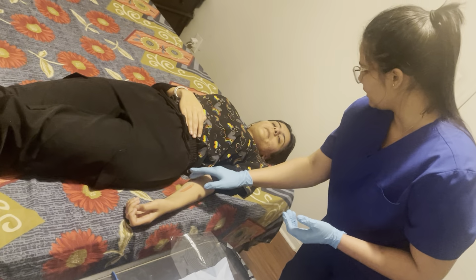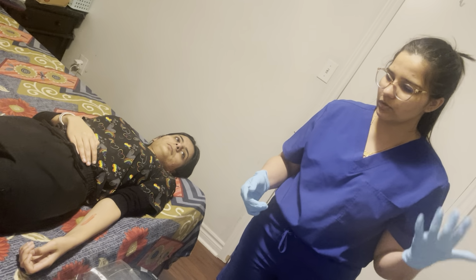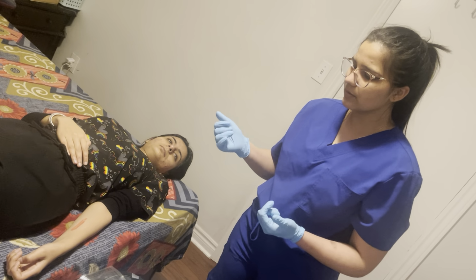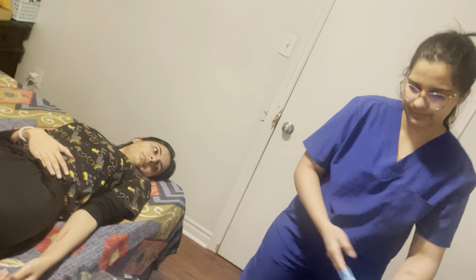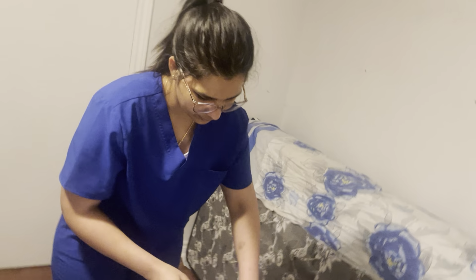Do you feel any kind of pain? No. Okay. So overall about the wound, the location of the wound is on the lower forearm on the left side, and it is 5 centimeter in length. It is close to each other and closed by sutures and well approximated, and there is no presence of edema. There is mild erythema that is present, and there is no pain present at the wound side. So after this, I'm going to discard these gloves. Going to perform hand hygiene and wearing the new gloves.